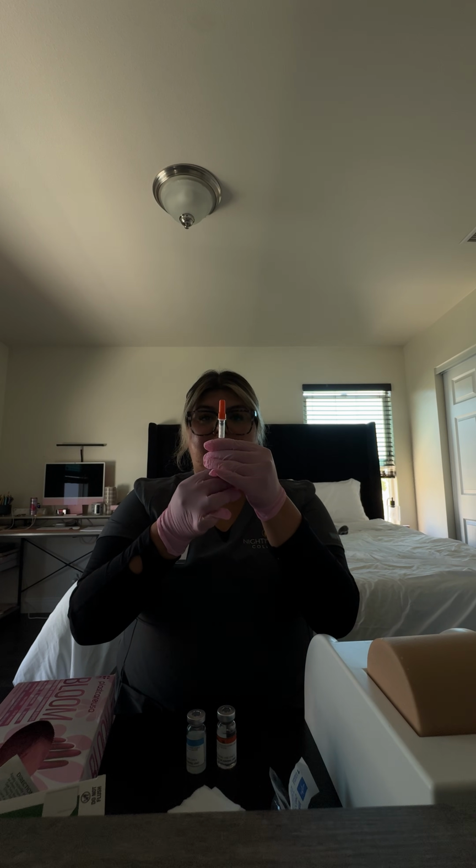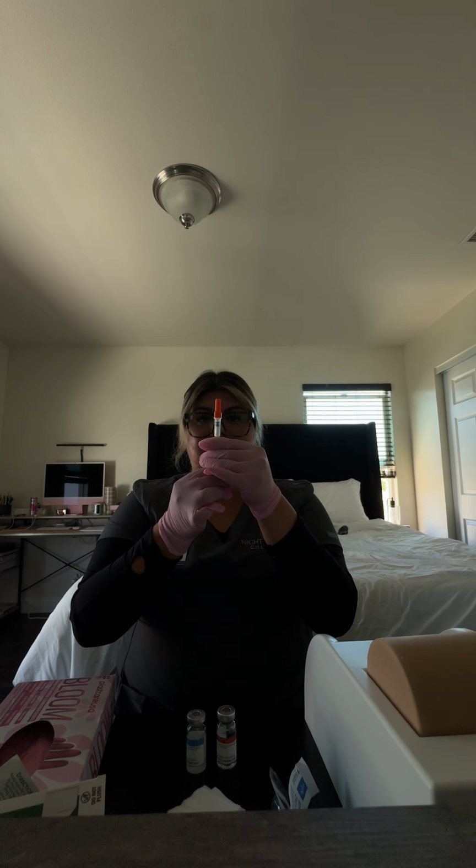I'm going to just dispose of this in the trash can. While the tops are air drying, we're going to open up our insulin syringe. And without removing the cap, we're going to draw up 8 units of air. Okay, so we have our 8 units of air. We're going to remove the cap. It is at 8 units.